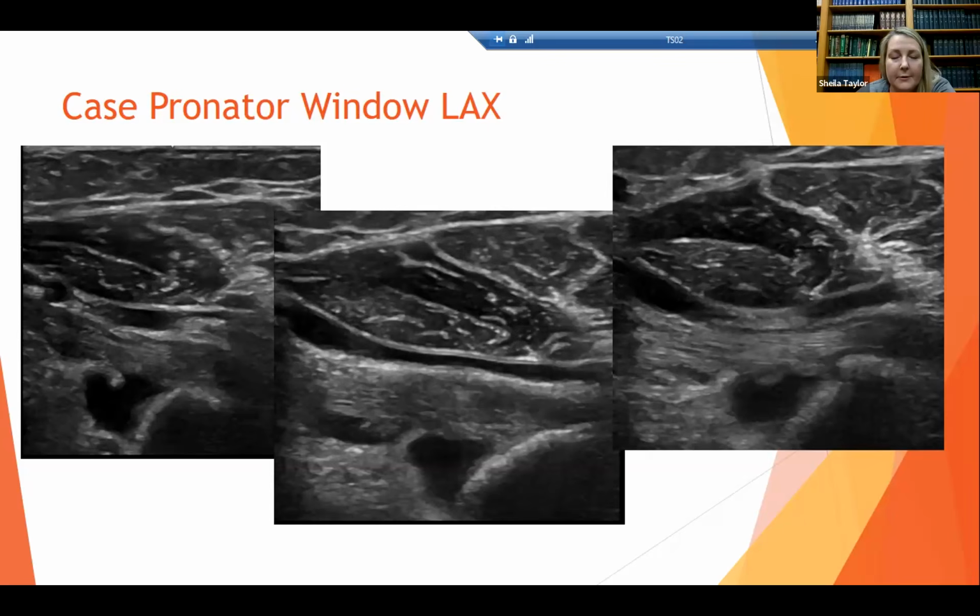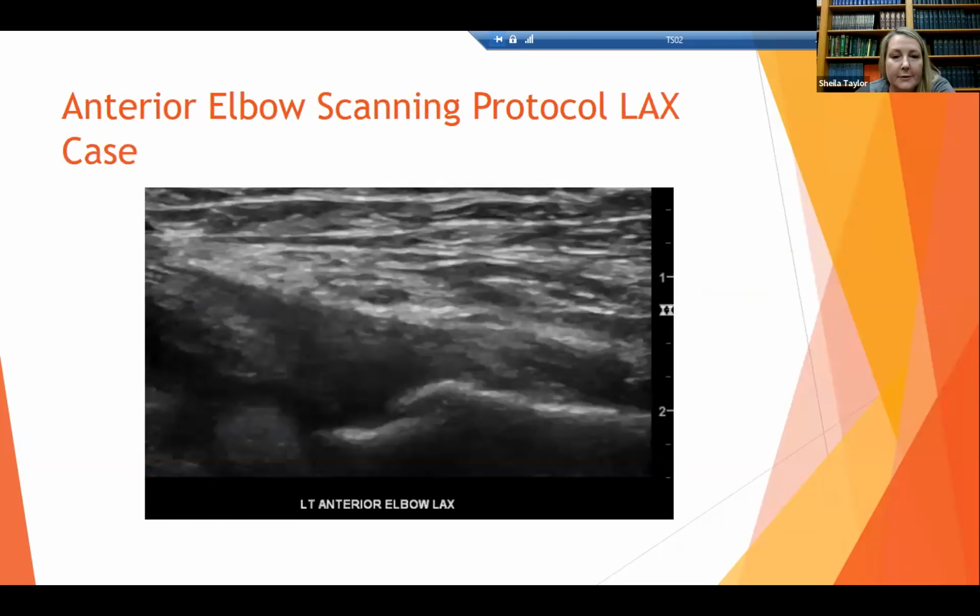I didn't aspirate from the pronator window. I did the standard view here, and with PDI identified the artery, and then I came a little more radial and found an access point where the bursa was most superficial. I wasn't coming through the tendon, and obviously wasn't passing through the artery. So I did it that way.